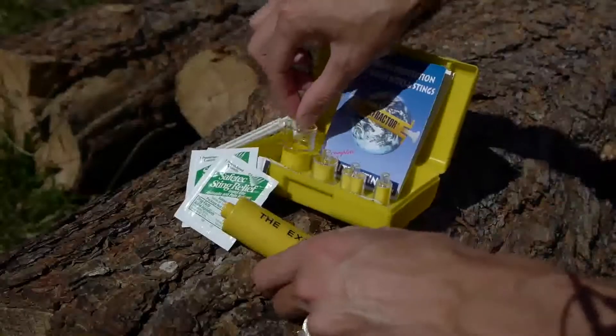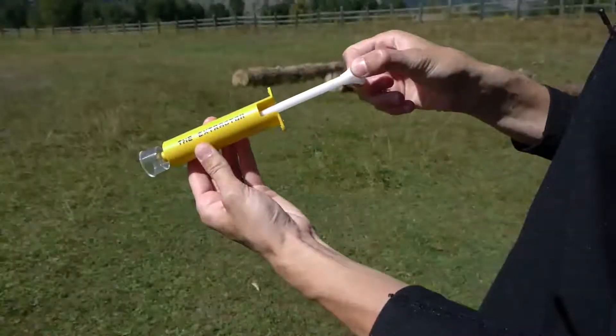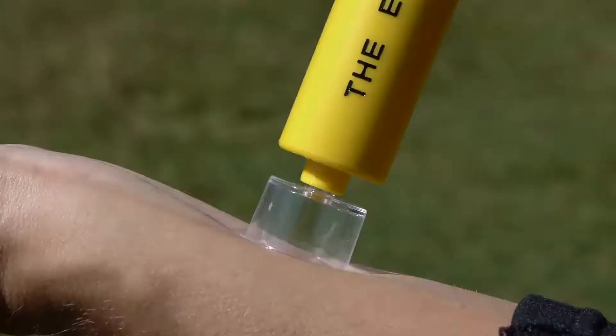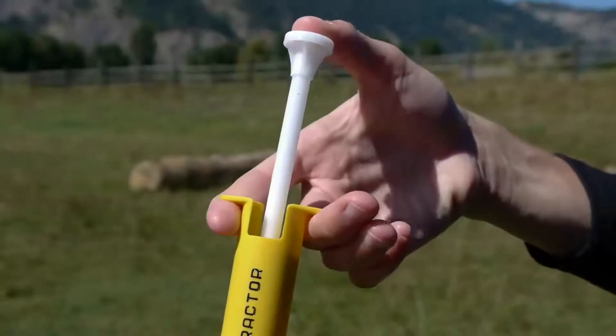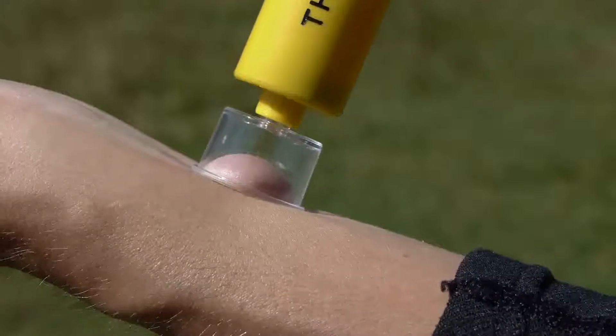There's no need to use dangerous blades or knives that come in less effective bite kits. To use the extractor, select the suitable size suction cup, pull the trigger to its full extent and place the suction cup over the bite or the sting. Using your thumb, press the plunger all the way in until you feel the suction and let the pump remove the poison.